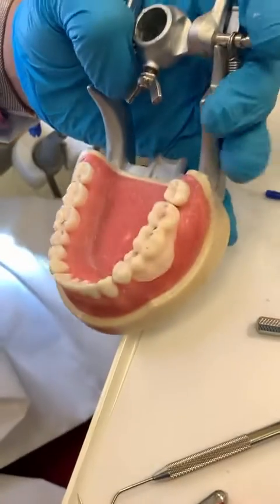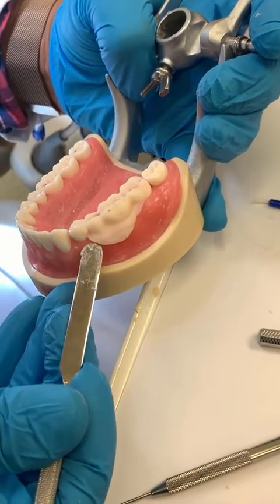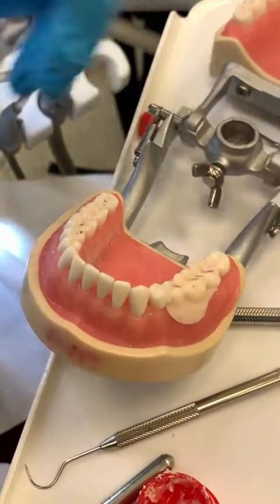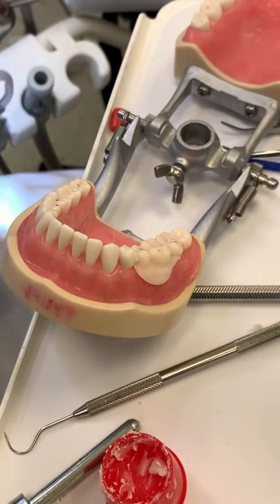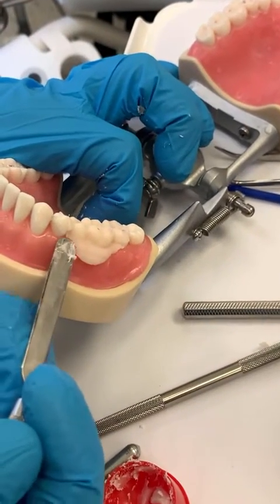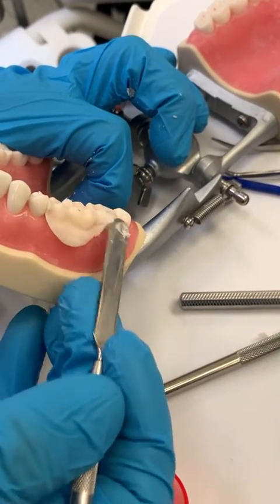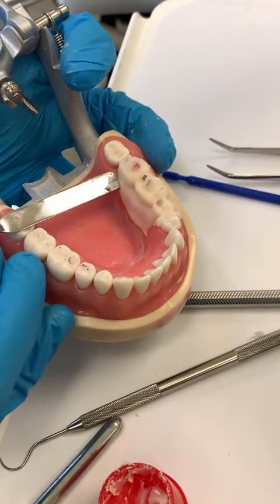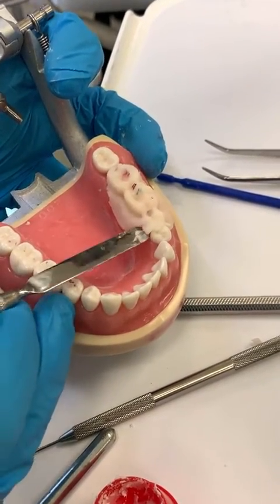The next thing I do is peel it off. I'm going to wait for the acrylic to be right, then fill it out real good. Put a lot of Vaseline so we can lift it up.